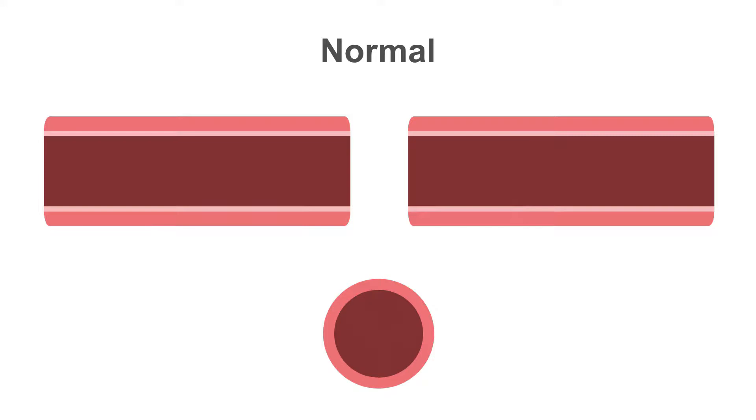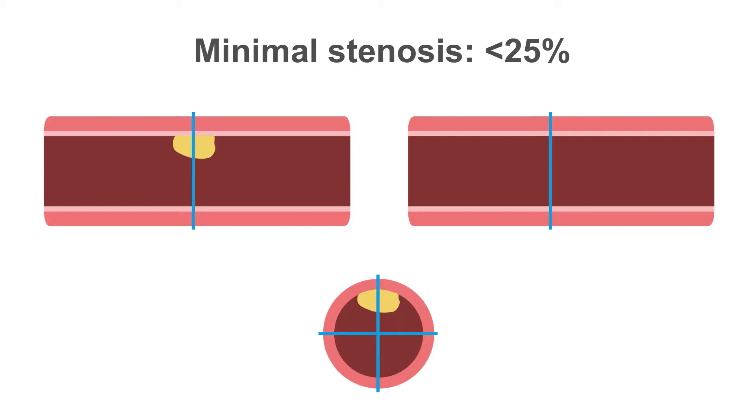A normal coronary artery is present when there is no plaque at all in any of the imaging planes. When you start to see plaque, I like to use my crosshairs to semi-quantify the plaque. In these images, we can see that the double oblique imaging has demonstrated a plaque in the lumen that occupies less than 25% of the luminal surface, or up to one quadrant made by the crosshairs. This is an example of minimal plaque.